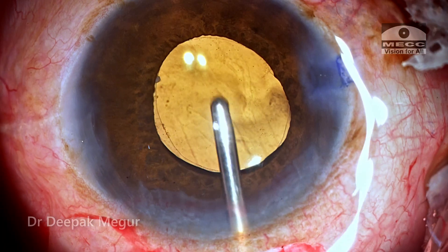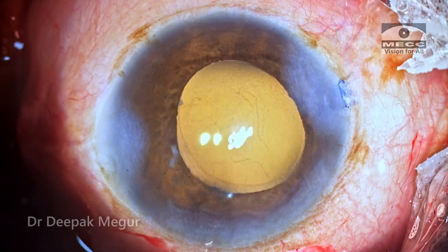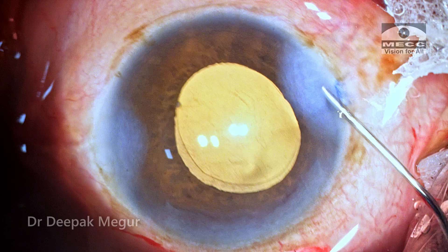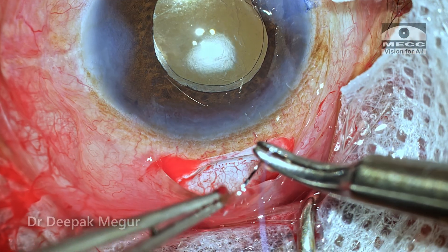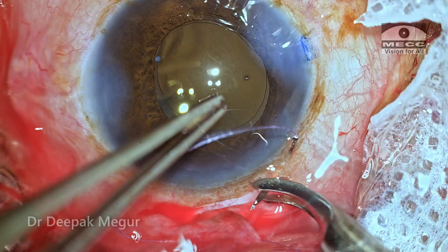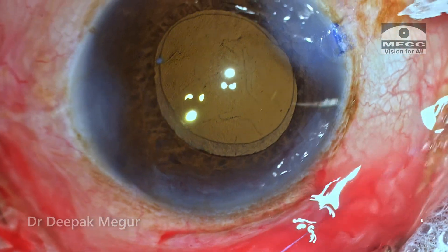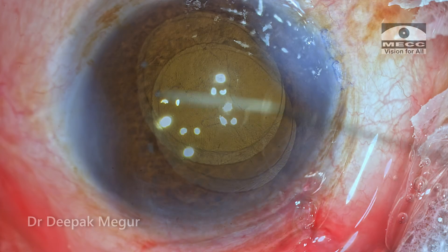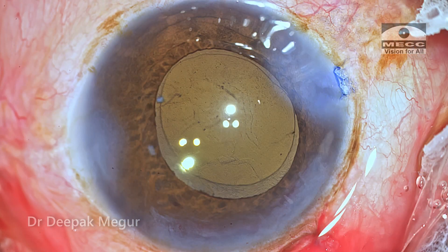The eye looks clean now. Time to close. The side ports are hydrated, and since the incision is a self-sealing one, I'm not going to suture the scleral tunnel incision. For the conjunctival flap, I always prefer to suture it using 8-0 Vicryl. The knot is tied in such a way that it gets buried under the conjunctival flap, so the patient does not have any uncomfortable sensation post-operatively.